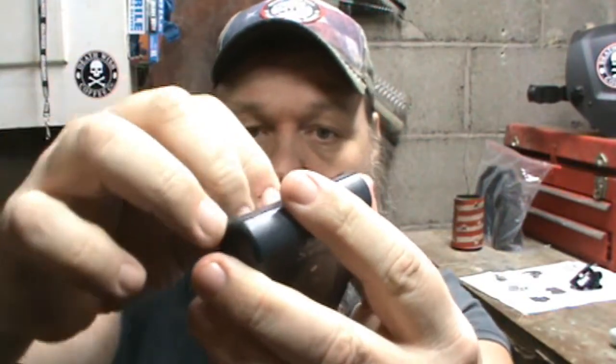When you peel this off, I'll just go ahead and do it. I got a bunch of these. Peel it, blue side goes to the unit, like such. And there you have it.